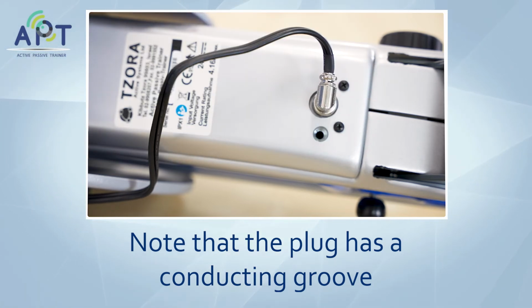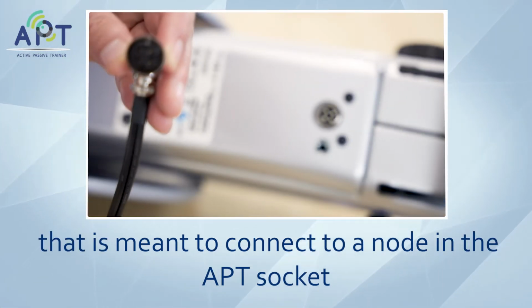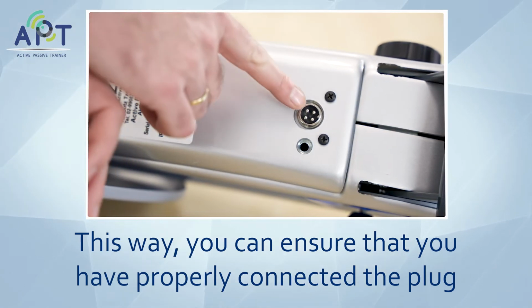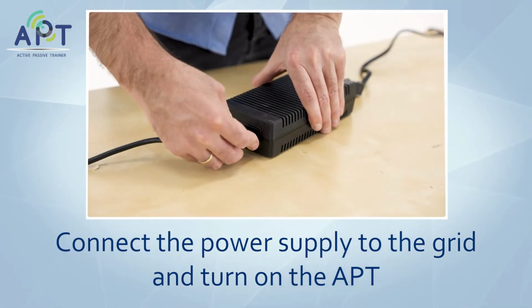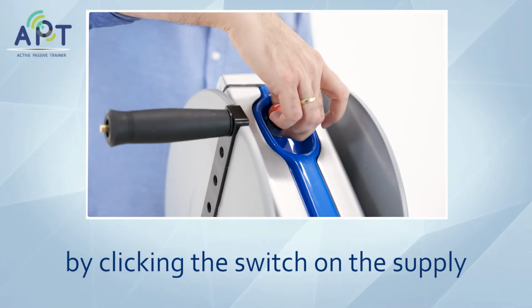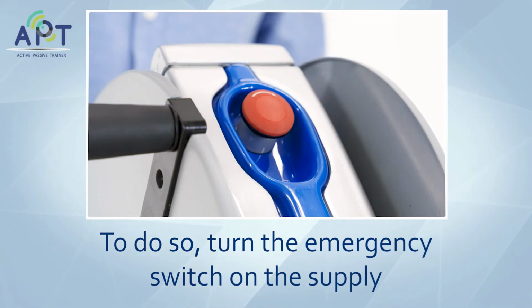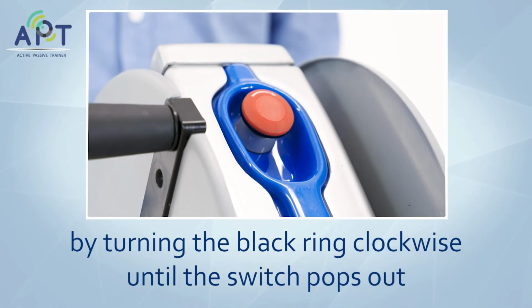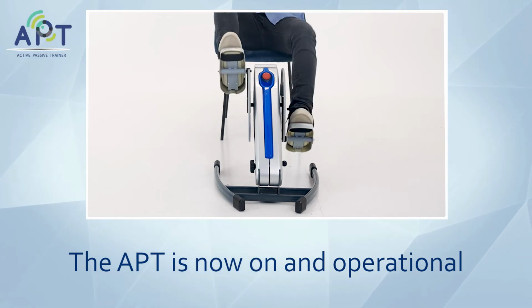Note that the plug has a conducting groove that is meant to connect to a node in the A.P.T socket. This way, you can ensure that you have properly connected the plug. Connect the power supply to the grid and turn on the A.P.T by clicking the switch on the supply. To do so, turn the emergency switch on the supply by turning the black ring clockwise until the switch pops out. The A.P.T is now on and operational.